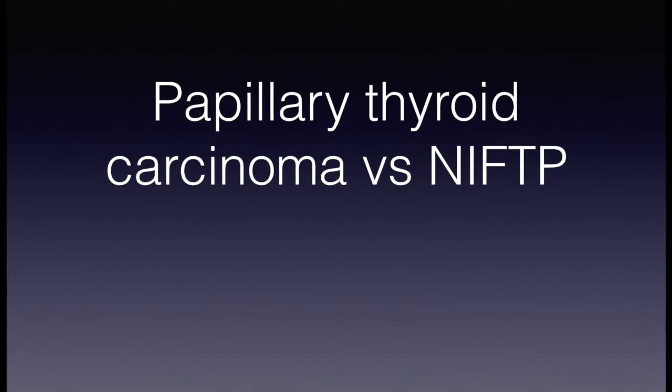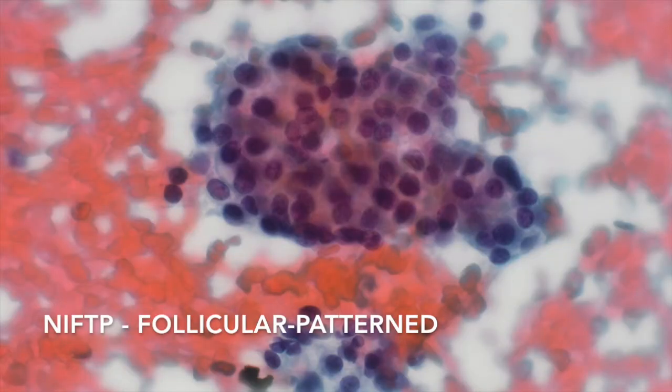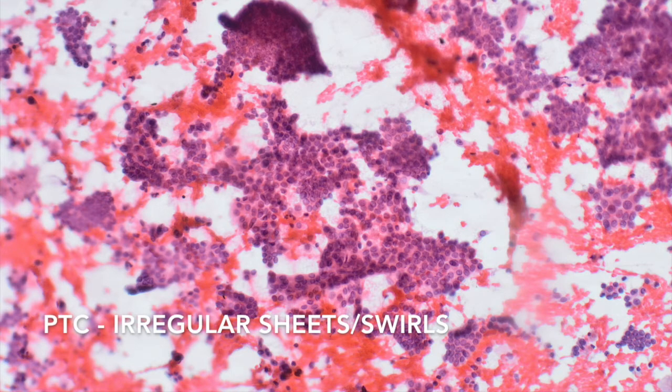The short answer? Yes we can. It's important to realize that the architectural features of NIFTP are those of follicular pattern lesions, as in this example, rather than the irregular sheets, papillae, and cellular swirls of papillary carcinoma, as in this example.